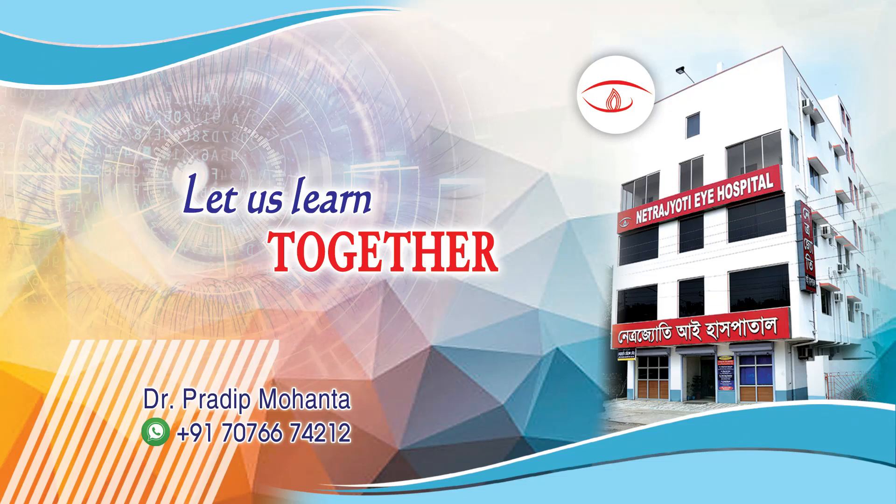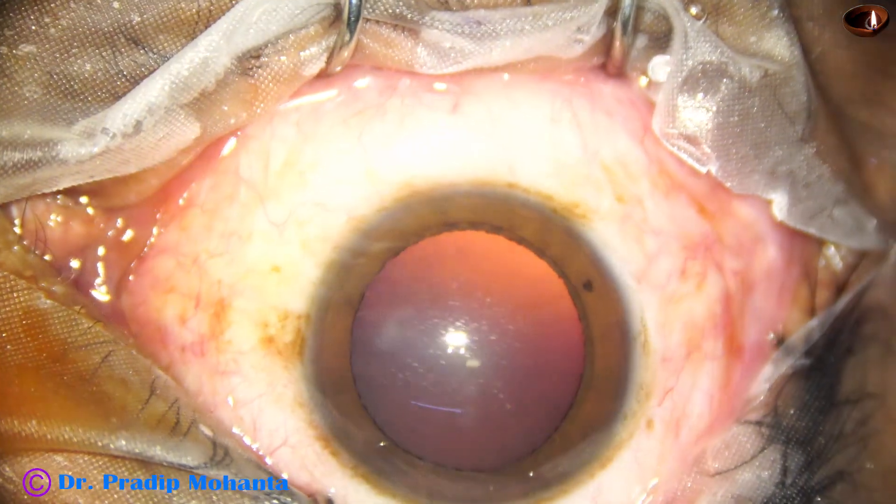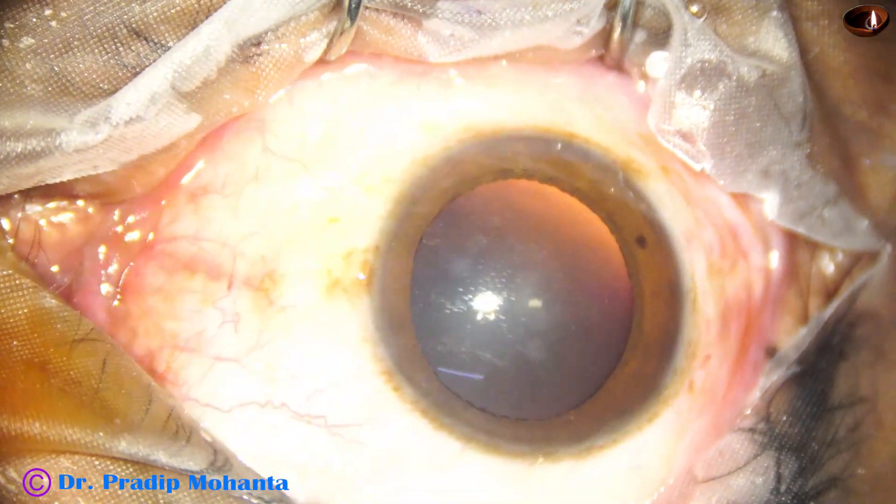Welcome to my workplace at Ranaghat, West Bengal, India. Let us observe this totally unedited clear lens FICO with intraocular lens implantation.